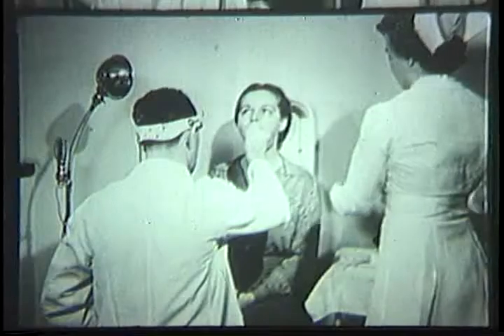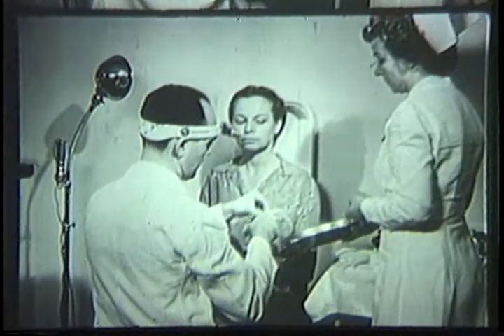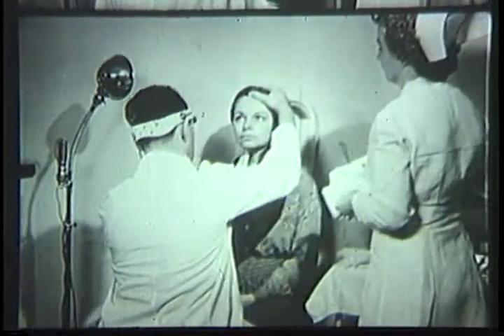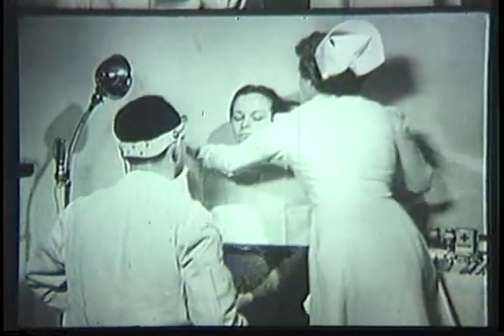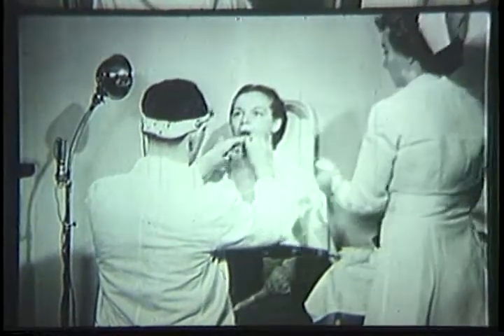The case history of Mrs. Gordon illustrates how the doctor diagnoses and prescribes treatment, while the nurse and technician assist him, each performing specialized functions during treatment and post-care of the patient. Mrs. Gordon has complained of a growth on the underside of her tongue, which doesn't heal.